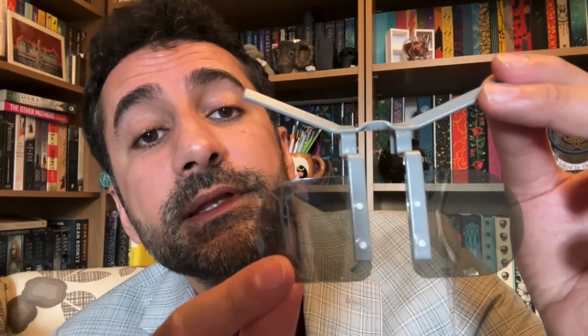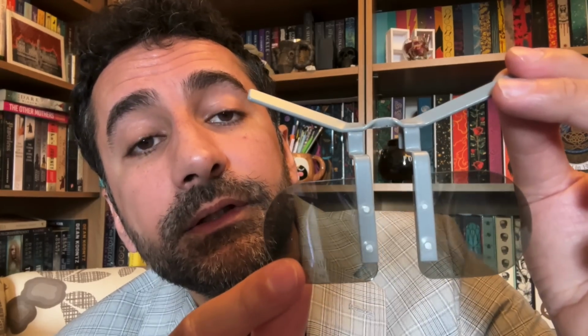Now these, or this device, are often used in the clinic after checking the prescription, distance and near. I hook over onto the special device that's on your face that you saw earlier. Do you know what this device is called? Any ideas?